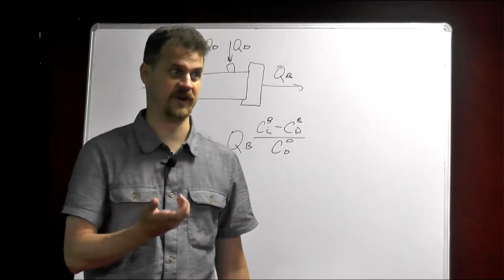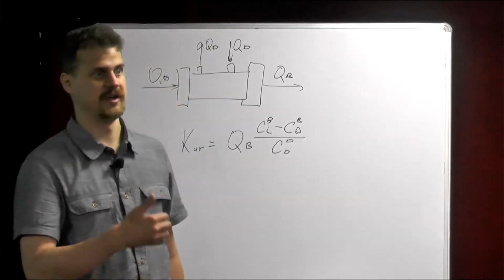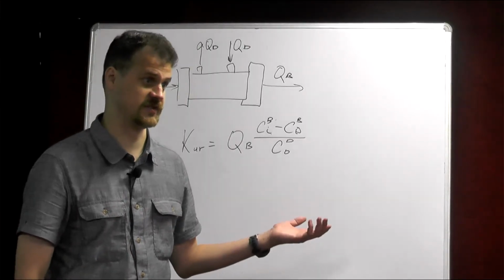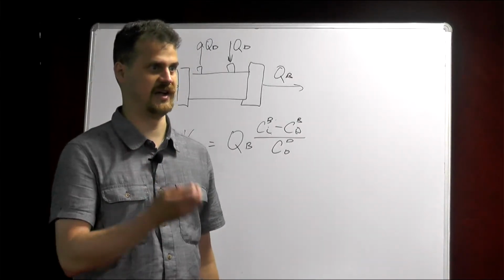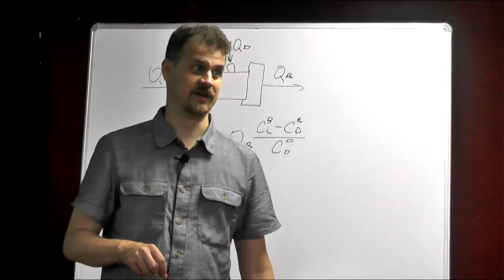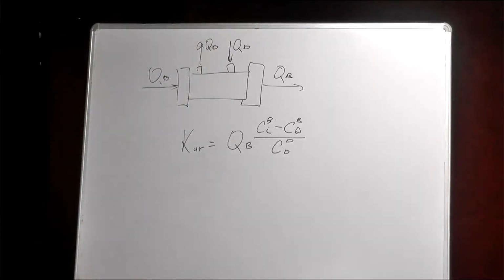So we need to find an approach to measure essential parameters like creatinine concentration, or urea concentration, or if we observe some nutrient concentration, it could be a glucose concentration sensor, etc. We need to make sure that we apply an appropriate method that allows us to miniaturize this sensor without affecting the ergonomics and the overall size of the implantable kidney.